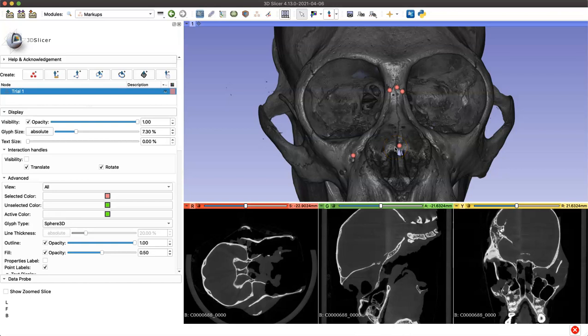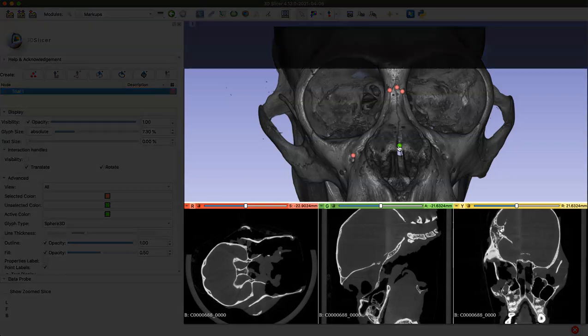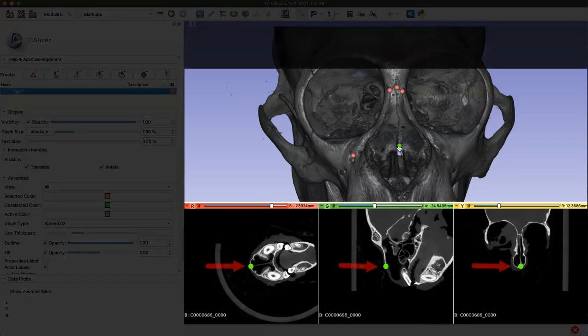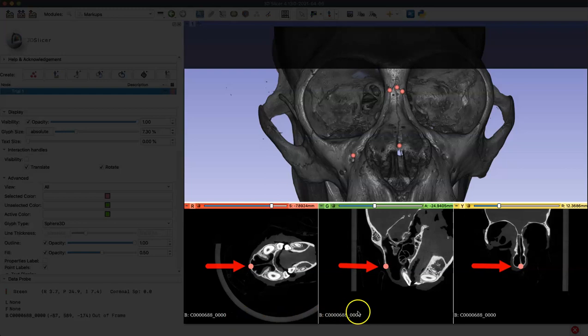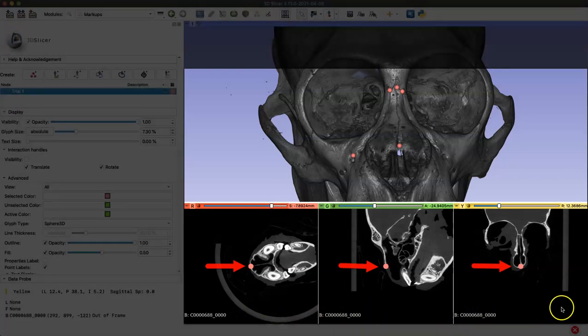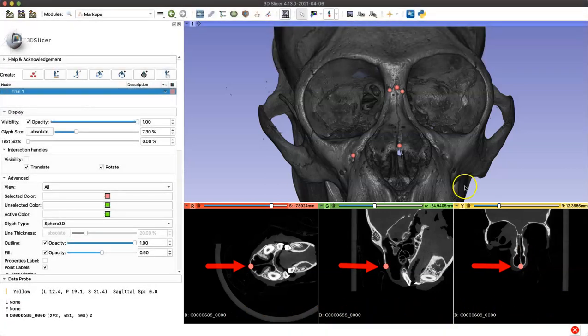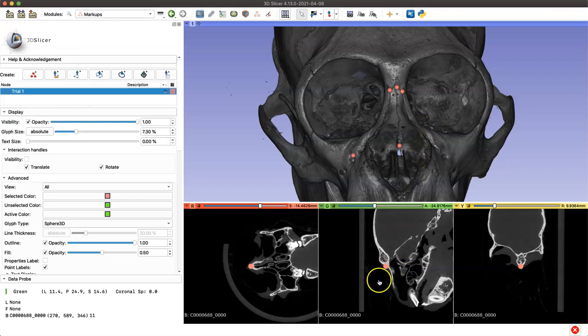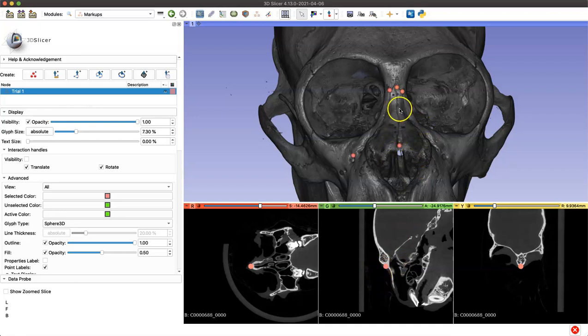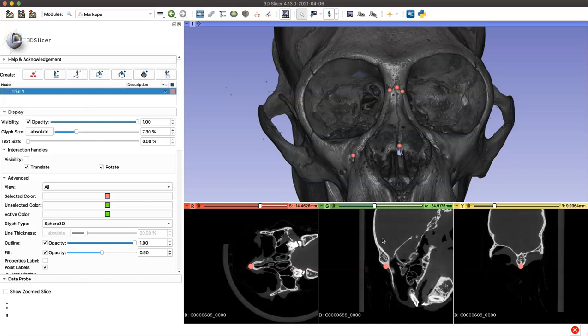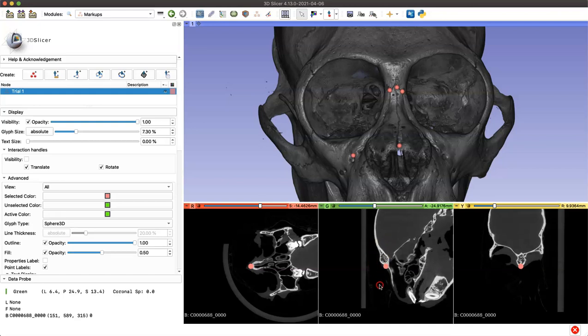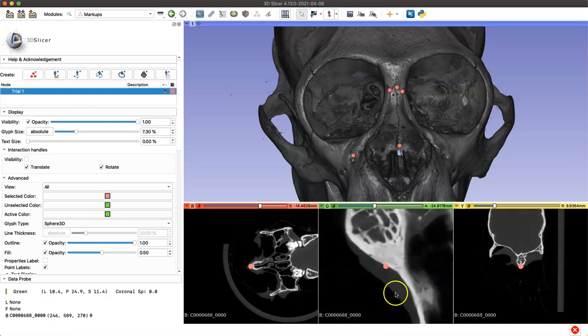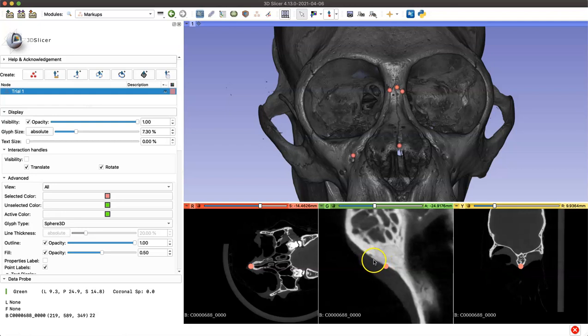Before we save our landmark data that we collected, I want to show you three tips that might help you with your landmarking process. First, if you hover over a landmark that you've already placed so that it glows green and you click it, your perspective slices below will all jump to the place where that landmark is. Here I'll show you one more time with a different landmark. This can be useful for a couple reasons. You can use those slices to more accurately move the landmark to the right anatomical place in 2D, and you can also make sure that the landmark is sitting right on top of the bone surface by zooming in and making sure that it hasn't fallen into a foramina or an unfused suture opening.